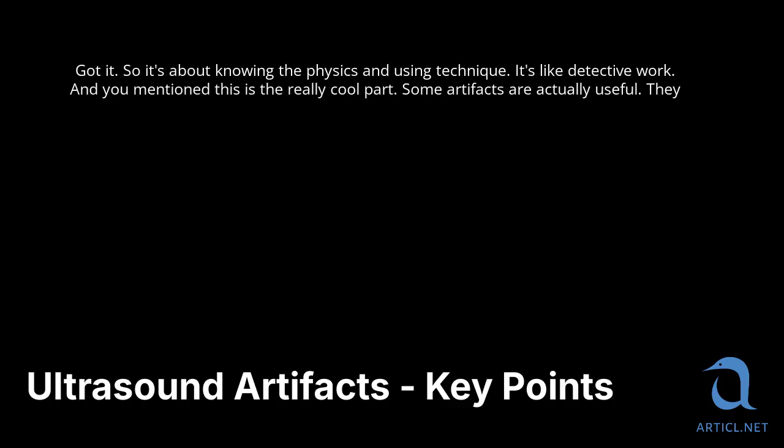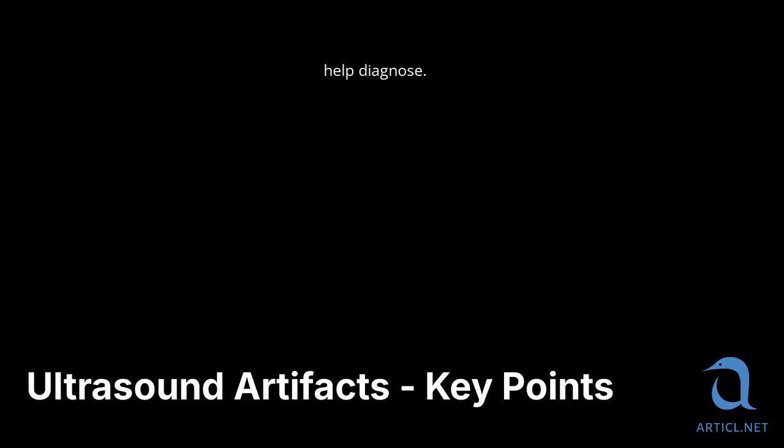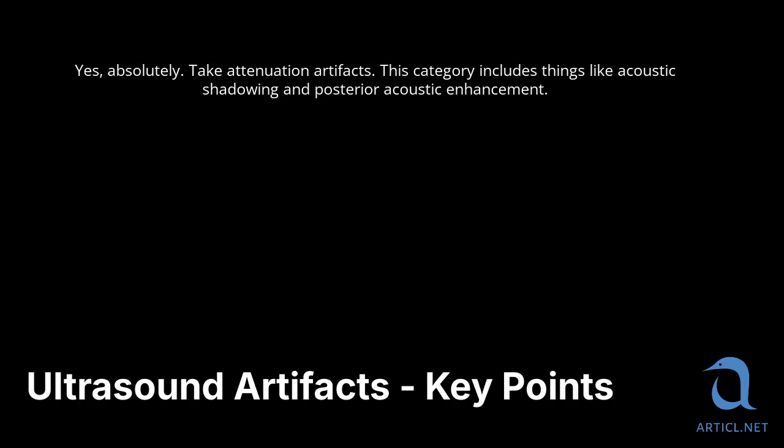Got it. So it's about knowing the physics and using technique. It's like detective work. And you mentioned, this is the really cool part, some artifacts are actually useful. They help diagnose. Yes, absolutely. Take attenuation artifacts. This category includes things like acoustic shadowing and posterior acoustic enhancement.